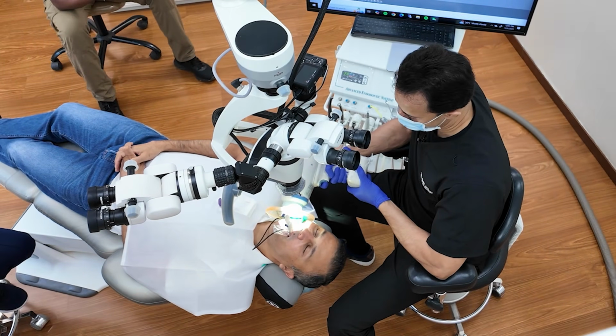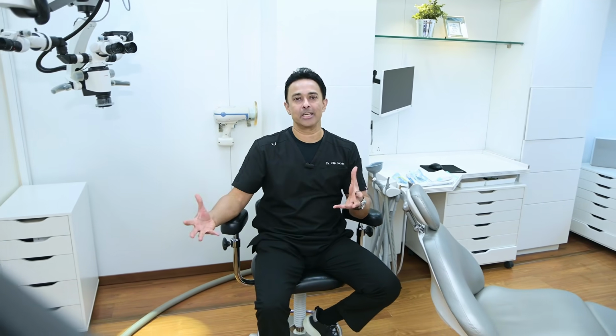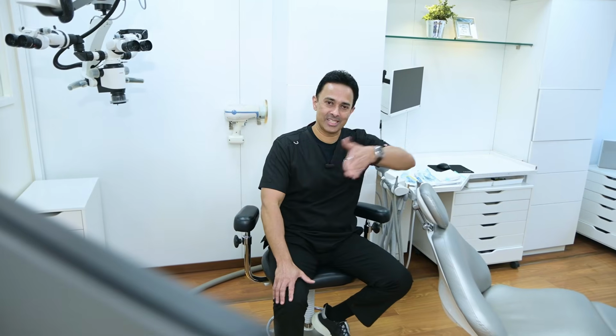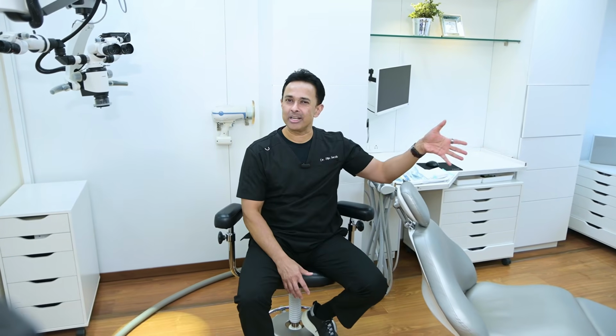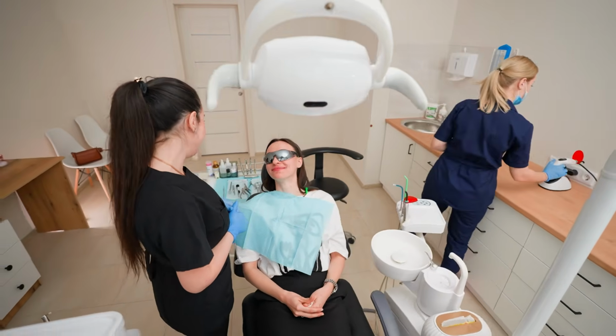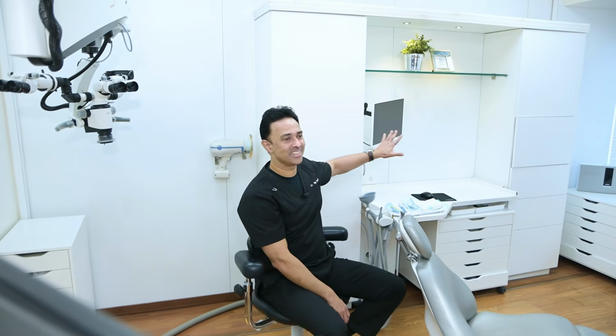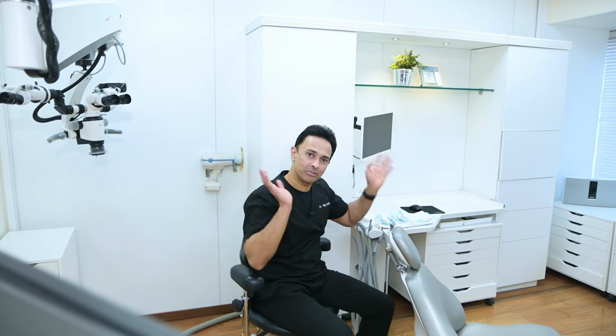And when it comes to storage, a lot of people go for these custom cabinets, which typical dental clinics have, where you have cabinets on the side. We feel the cabinets on the side are wasted because every time you want to reach for something, the assistant has to walk up to those cabinets. So what we've done here is we've put IKEA kitchen cabinets. IKEA has a whole range of kitchen cabinets.